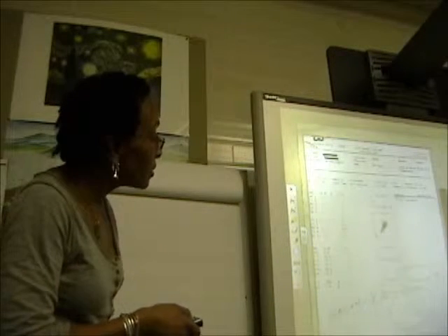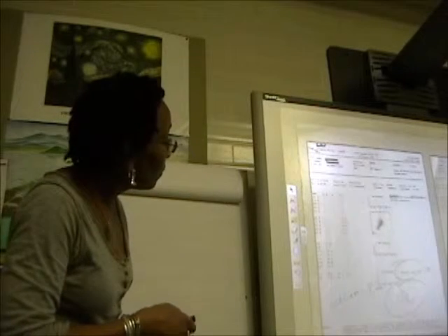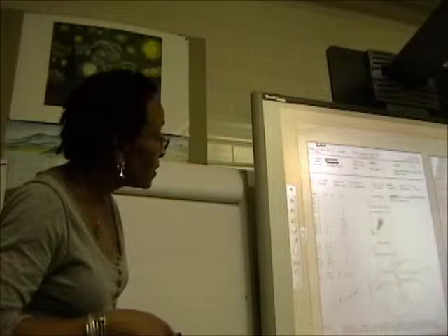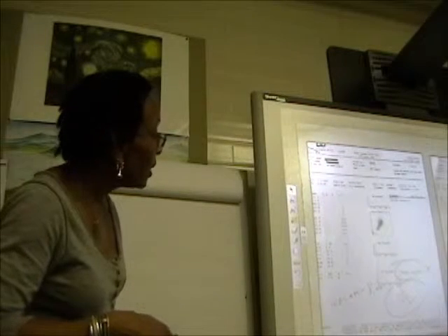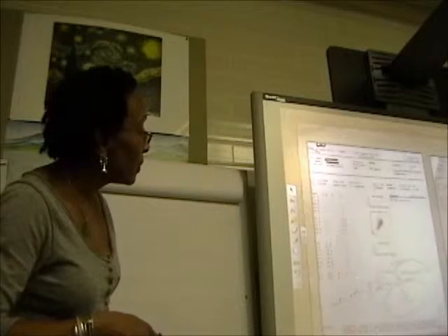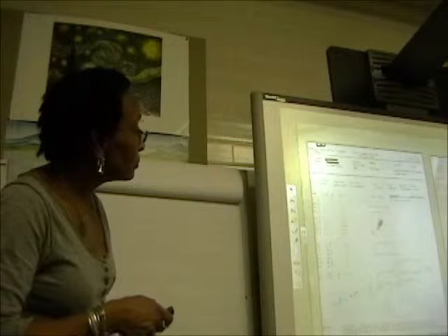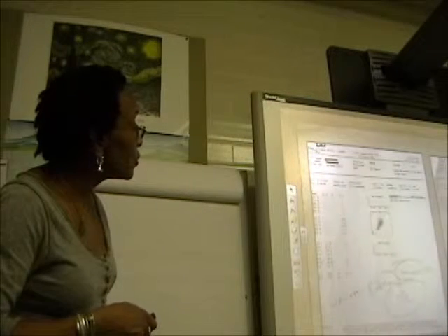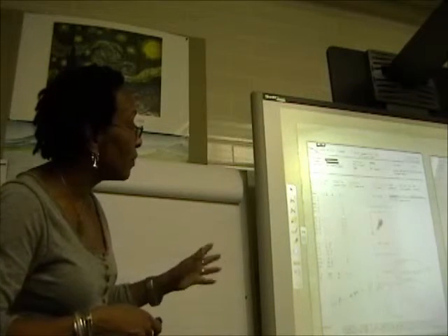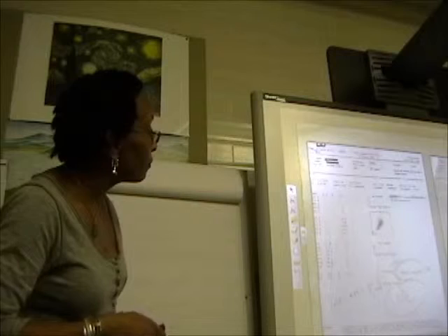And the next slide shows what they did on the two different instruments. He ran them on two different instruments, and he still had to do a WBC estimate and a diff. But he didn't send this for a pathology review. And this is just to show you again how on the different instruments you could have slight variation between the two instruments, but they're really not that far off.